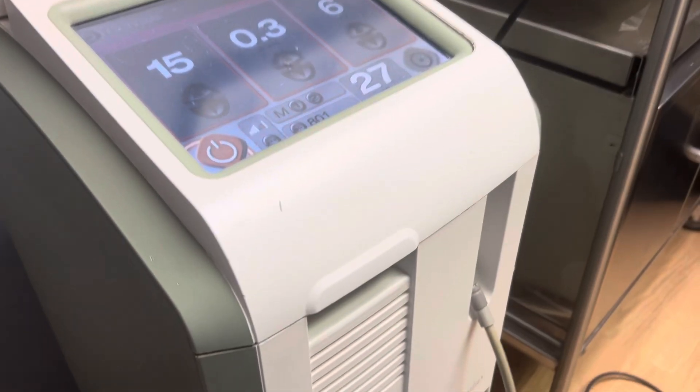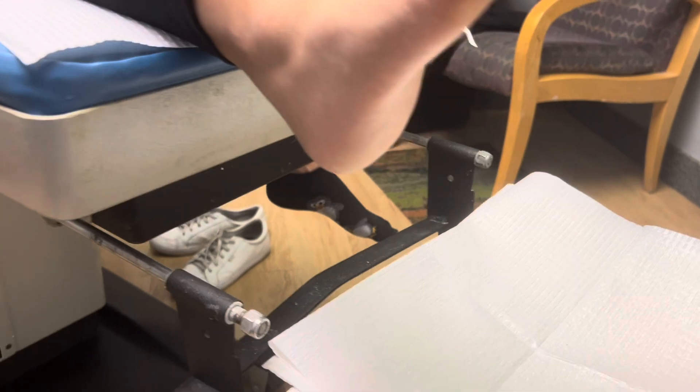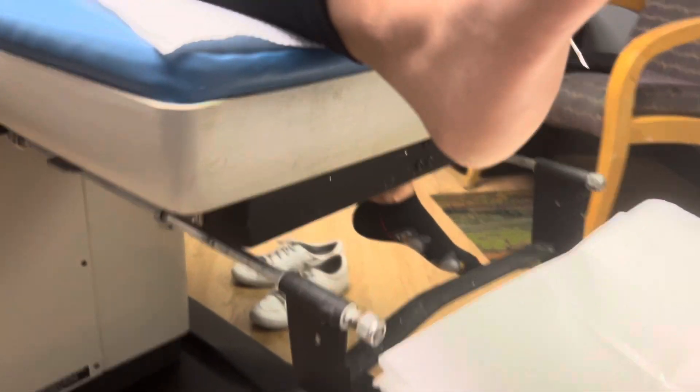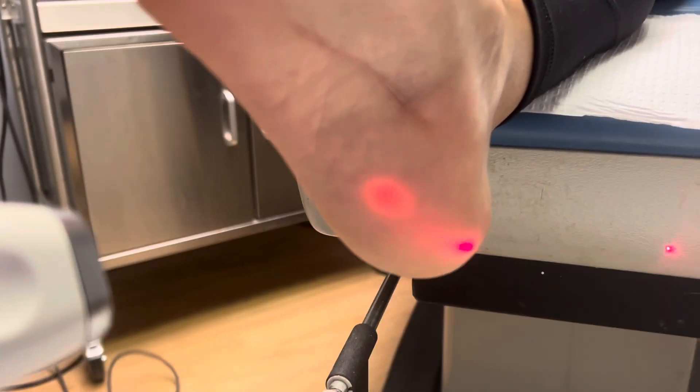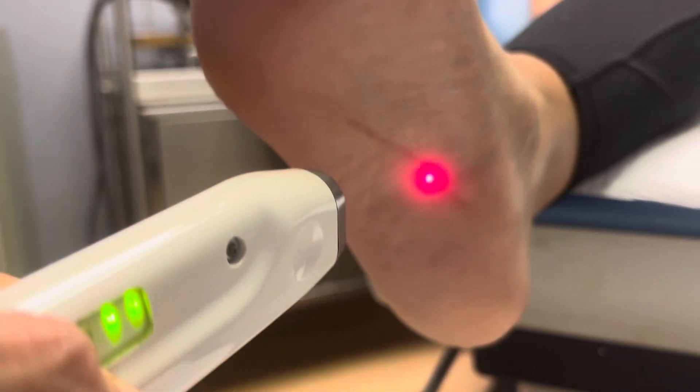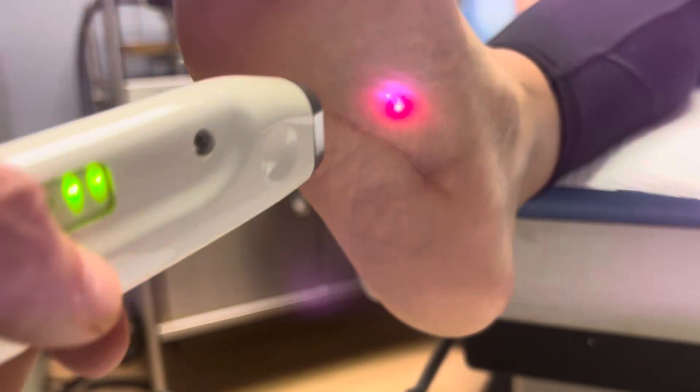We're going to take a look at the scar and talk about a laser treatment that has helped her. The patient shares: it was mostly the nerve damage that resulted from the glass — it was just uncomfortable. But after the laser it just felt better; the movement in my foot improved, I was able to walk better and not feel that hypersensitivity that I used to have.